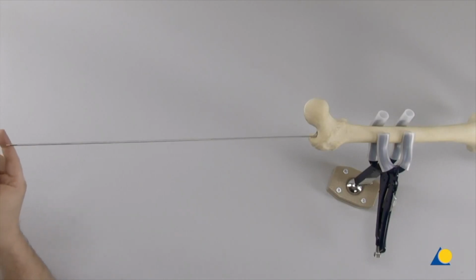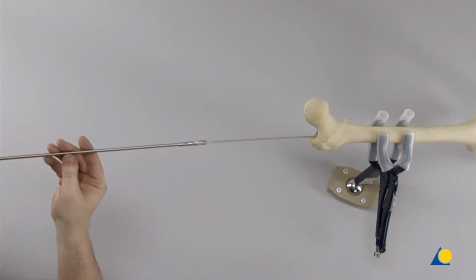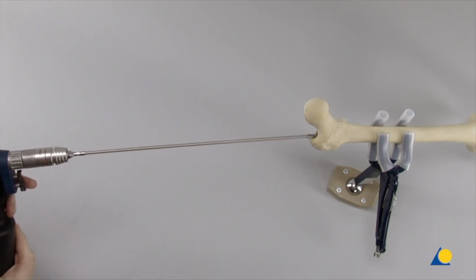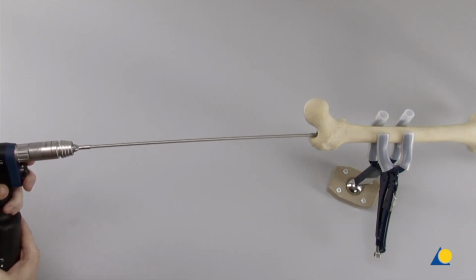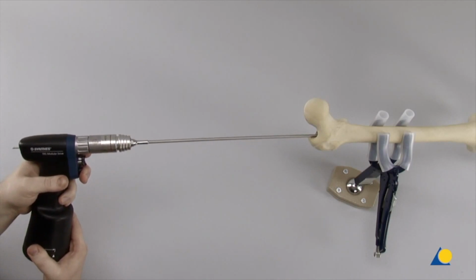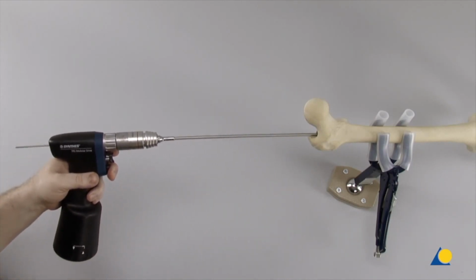Reaming begins with the 8.5 mm diameter reaming head and is repeated in increasing increments of 0.5 mm until a diameter of 0.5 to 1.0 mm greater than the nail diameter is attained. The reamer is advanced with steady, moderate pressure and regularly retracted to clear debris from the medullary canal.